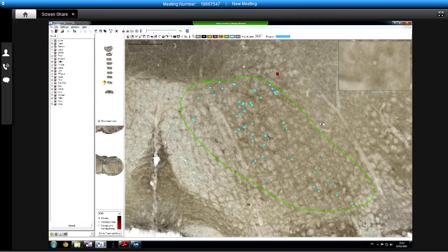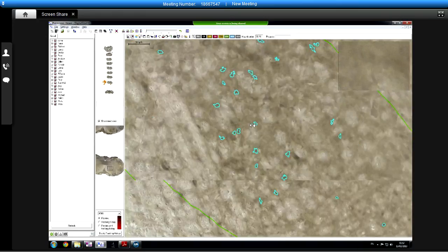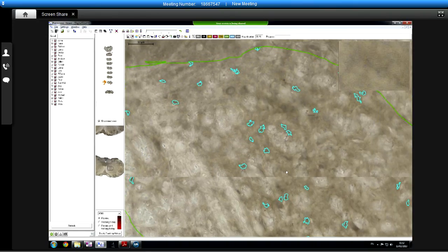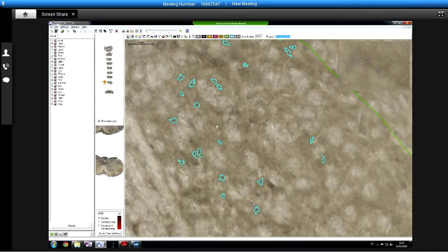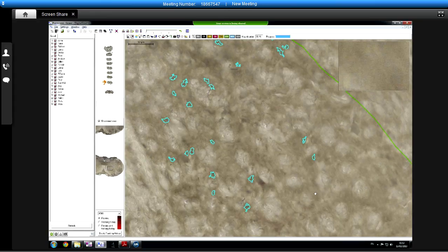So we could look at this and go, do you think we're getting the right idea here? Or do we need to play around a bit? It might need a bit of tweaking. But no, I thought it would do at this stage. Yeah. Oh, they look about right. Yeah, they look okay.